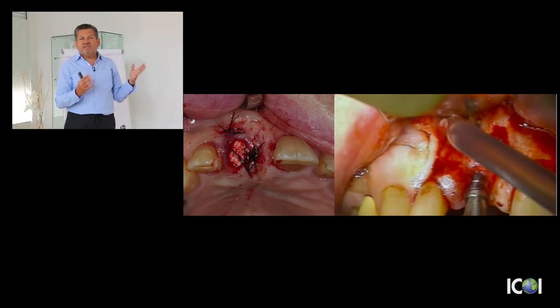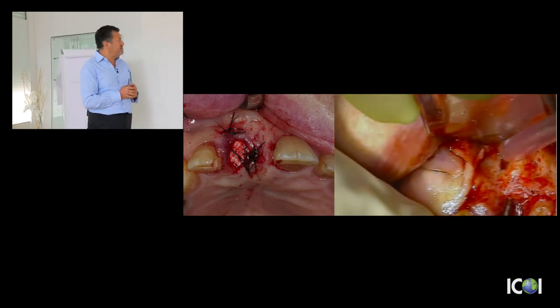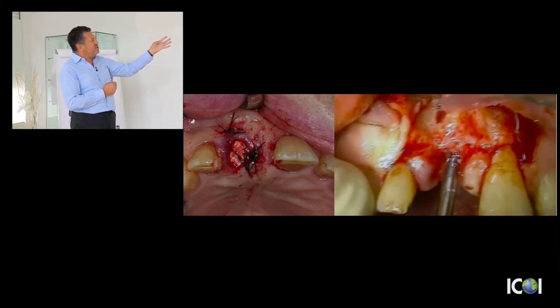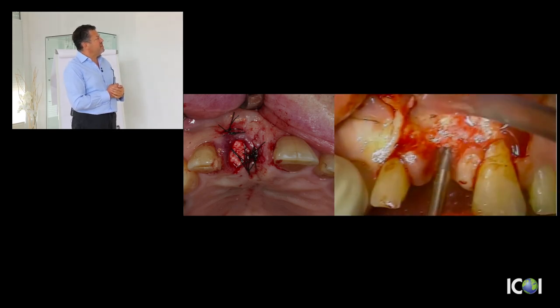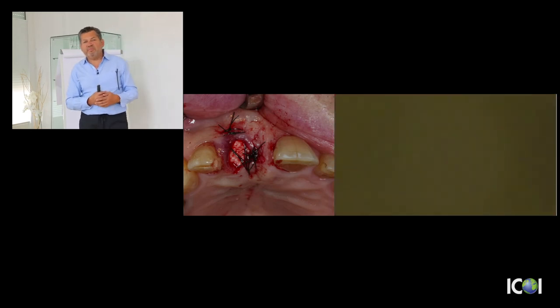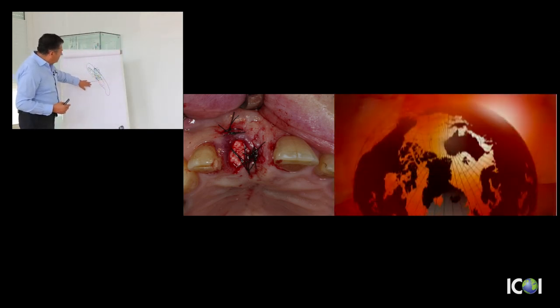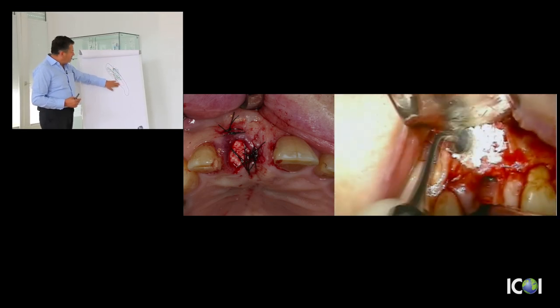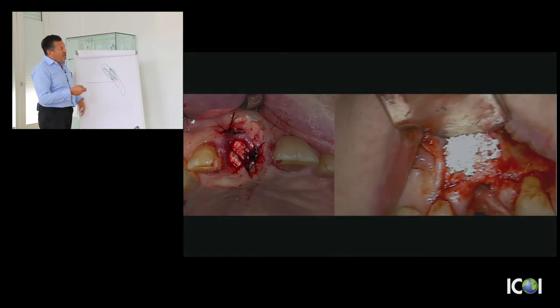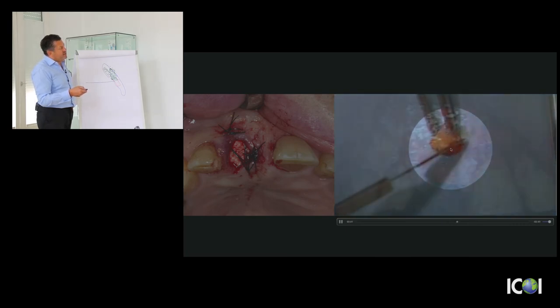ST2 means we use allograft in combination with xenograft, but we place the implant into the socket where we had one-third missing buccal bone — a dehiscence of one-third. We can now assess how this new bone behaves when proceeding with our osteotomy and placing the implant. This allows us to place the implant in the ideal position with a very good aesthetic outcome, ideal implant positioning for screw-retained or cement-retained crown, and gives us the possibility to add some GBR at the apex when needed — but only when we have enough implant stability.